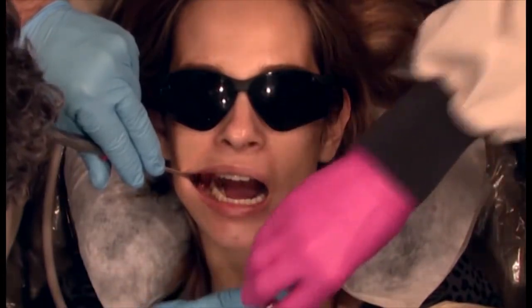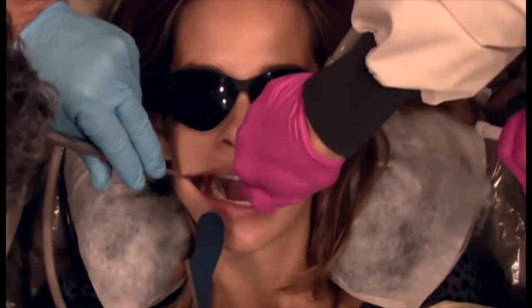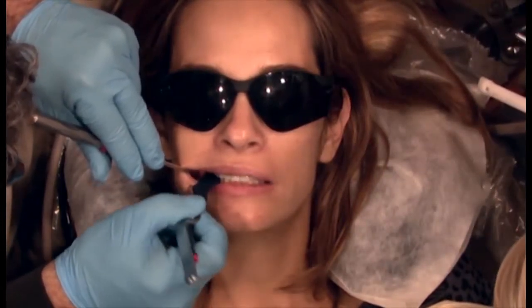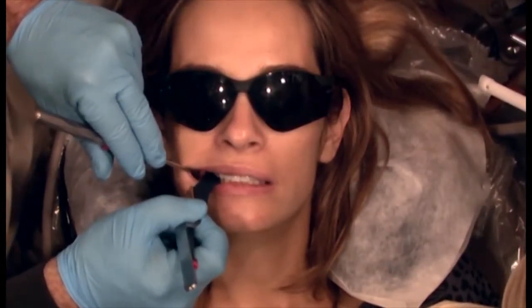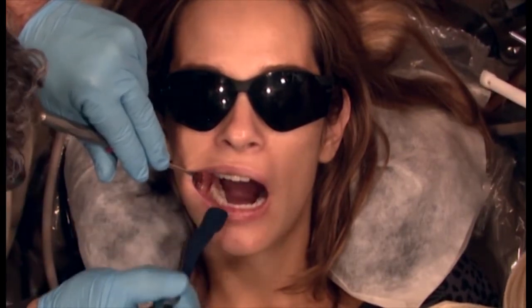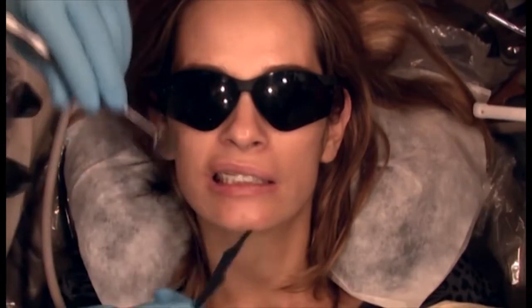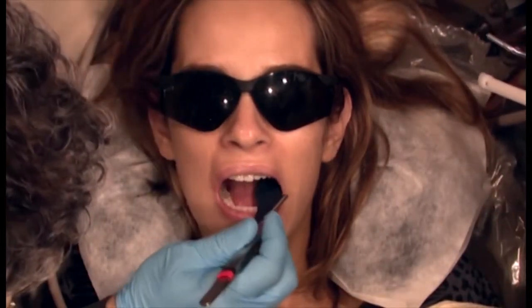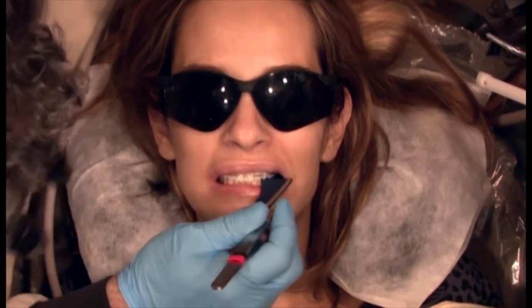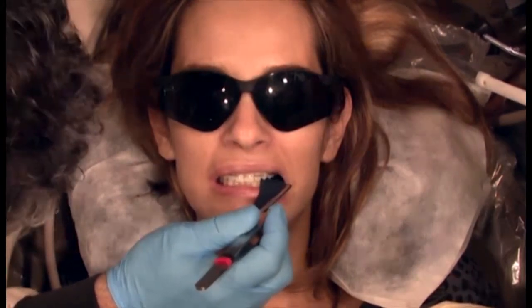Remember, our thick articulating paper is 200 microns. Close down. And see, this is tight. I cannot pull this out. Open. That means she's within 200 microns of actually touching the teeth. Same on this side, although this side is a bit looser than the other side.